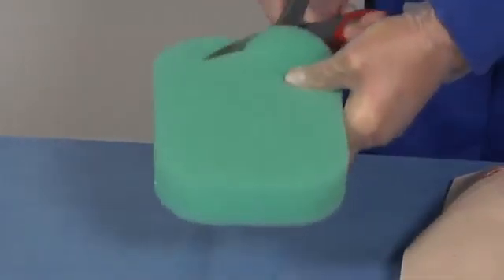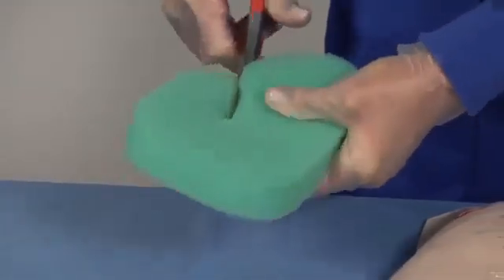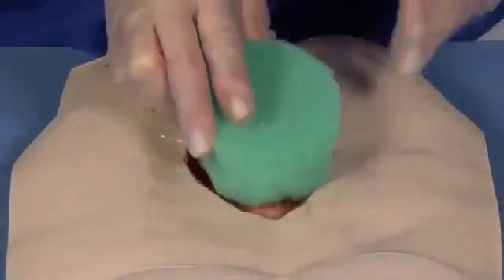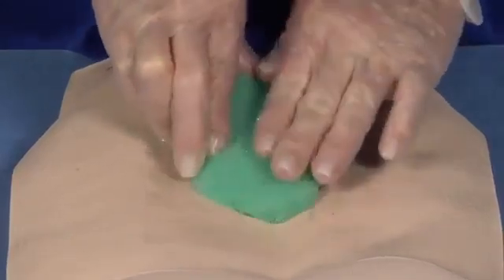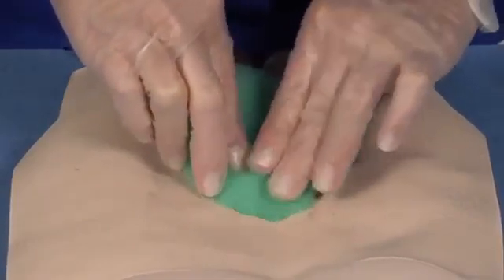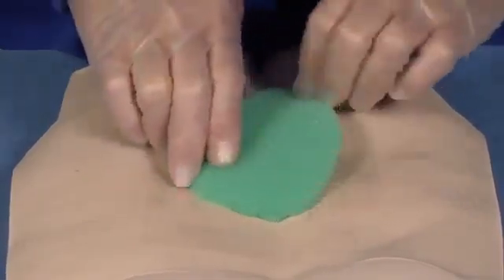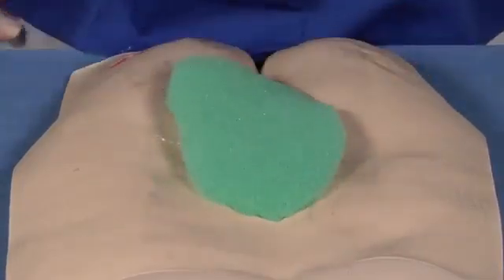Now cut the foam to match the size of the wound. Do not cut the foam over the wound bed. Place the foam in the wound bed, ensuring it fills the entire space. As a guide, the foam should extend approximately 2 cm above the wound edge. Remember to note if any additional pieces of foam were used to pack the wound.